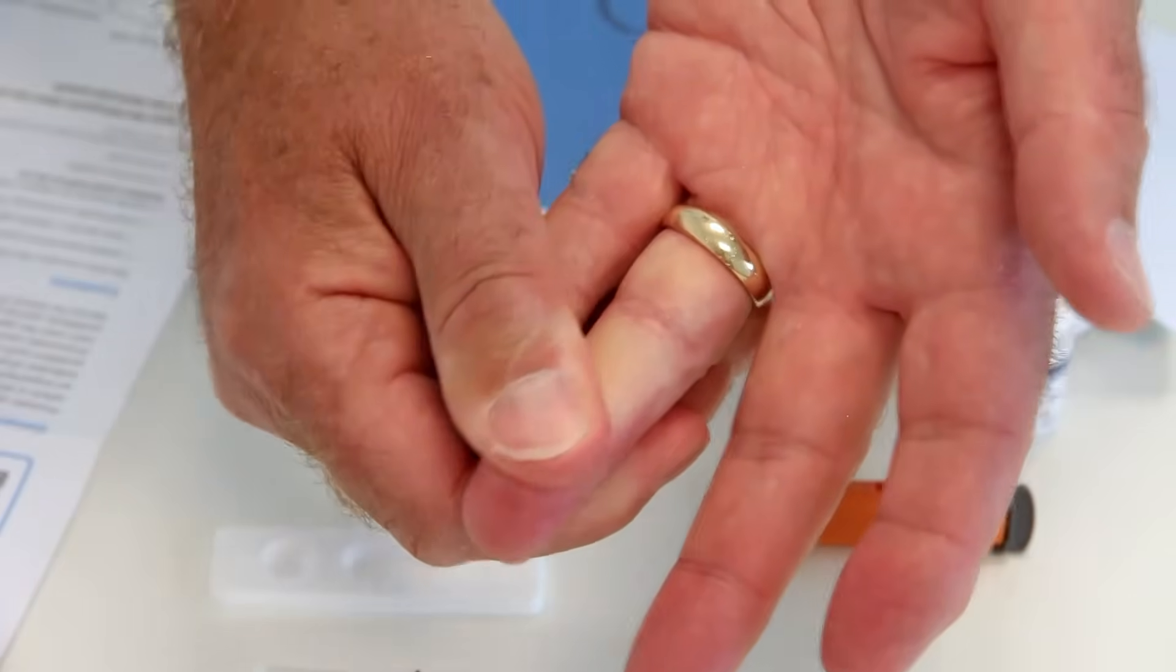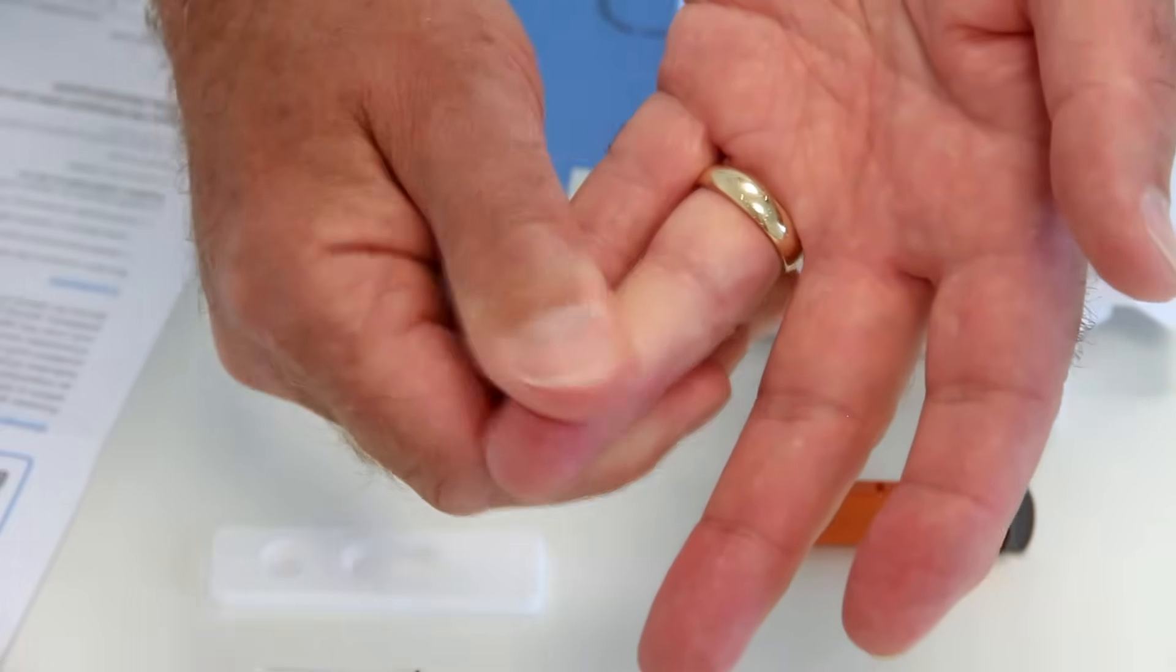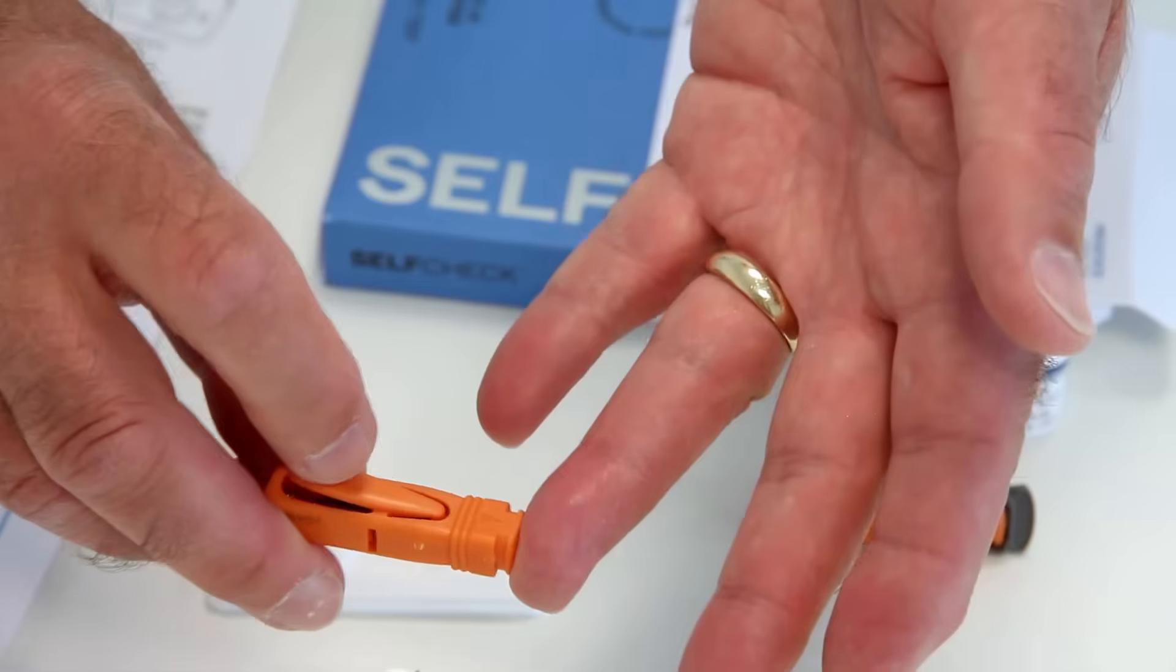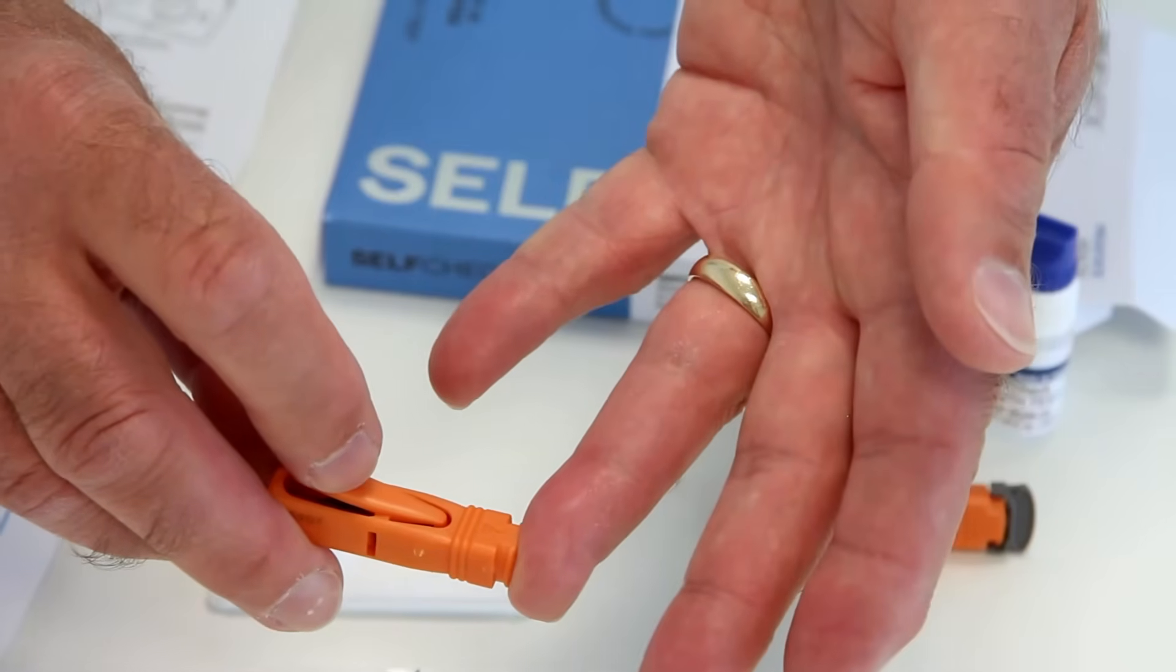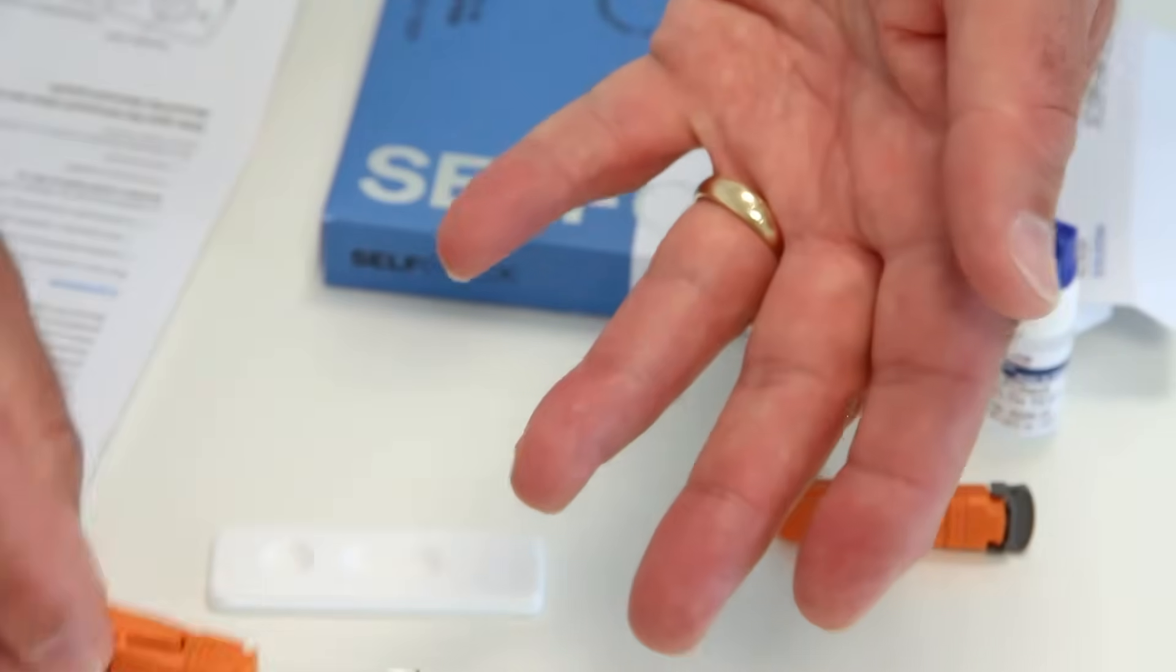Massage your finger again to increase the blood flow. Then press the lancet firmly against your fingertip, then press the trigger button to fire the lancet needle. You will hear a click.